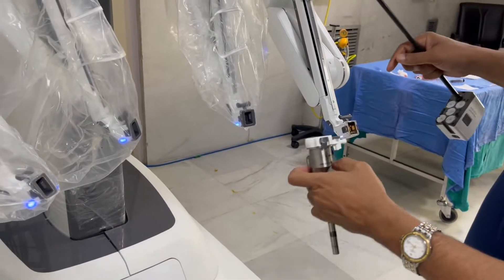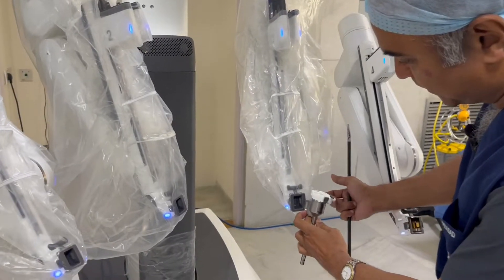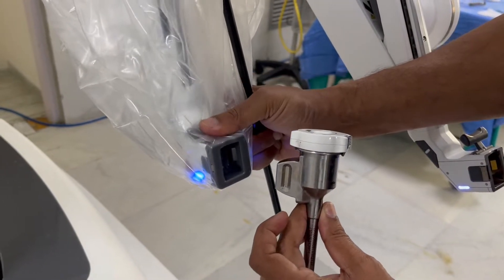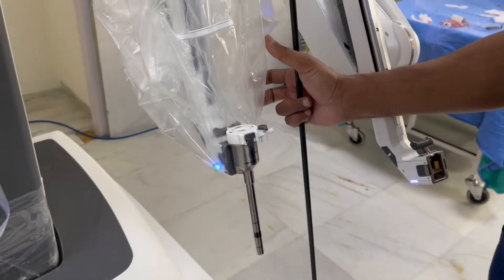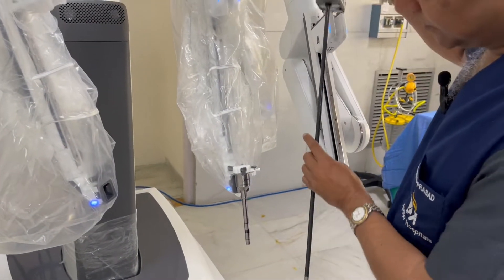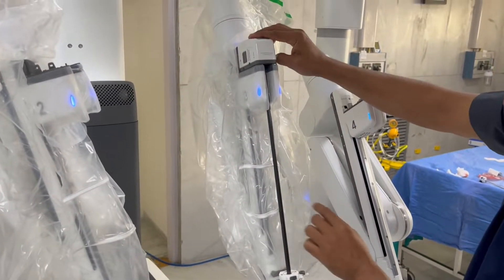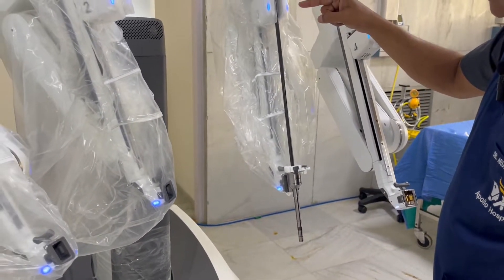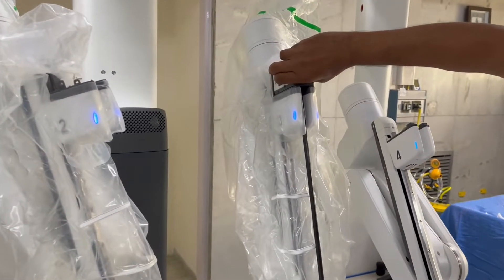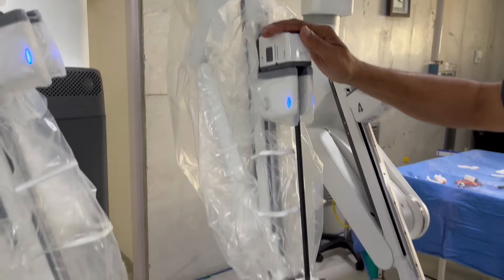I will show you how this trocar gets docked. This is a sterile drape which has been applied here, and if you come close, you will be able to see this trocar gets docked. We just have to press this, put it in, and that's it. Install the endoscope for targeting — then we hear instructions from the robot. Now look at the instrument that goes inside. It has gone to its position and I am moving it down further to its desired position.